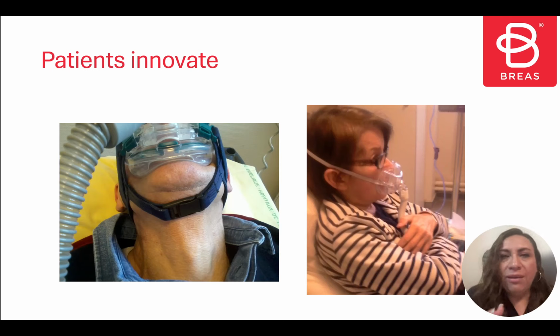With that, what I wanted to say is that it's very important to adapt to patients. Communication is very important. Therapeutic education. You have to explain to patients why it's important to, one, use ventilation well, two, not to have leaks, which makes ventilation less effective, and what should be done to avoid injuries, and in case of injury what should the patient do.